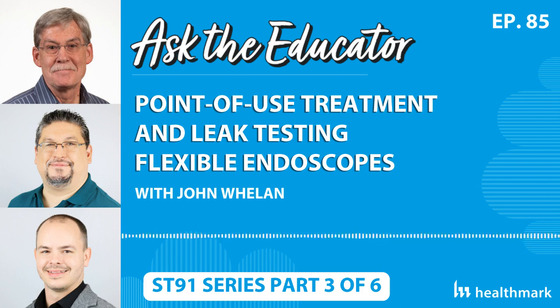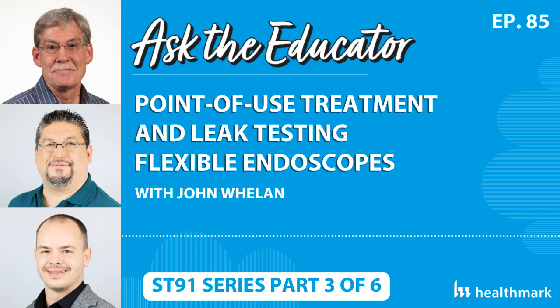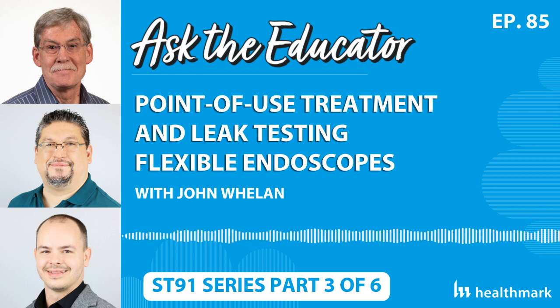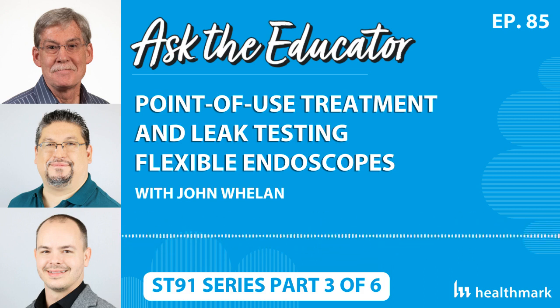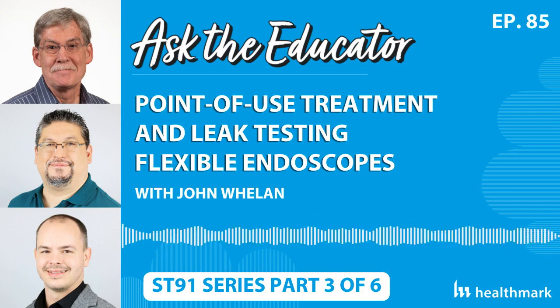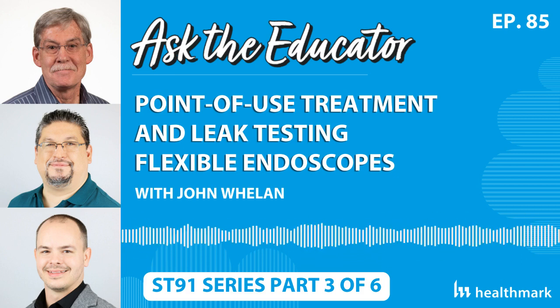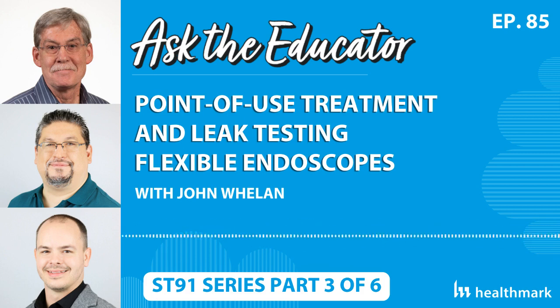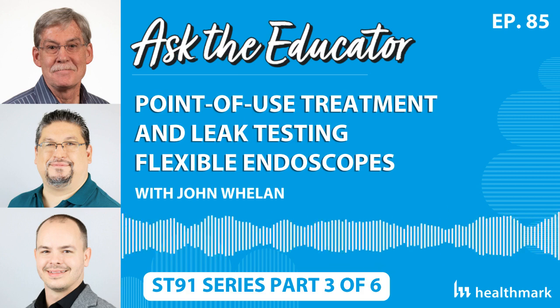So it should be solid container transport, solid bottoms and sides. The top doesn't need to be solid, but again, it needs to be of appropriate size. Not all scopes are the same size, obviously, and you don't want to cram a colonoscope into too small a container, for example, or a small bowel endoscope. So it needs to be of appropriate size. It needs to be solid on the sides and the bottom, and the labeling of the container needs to make it visually obvious that it's soiled contents within.